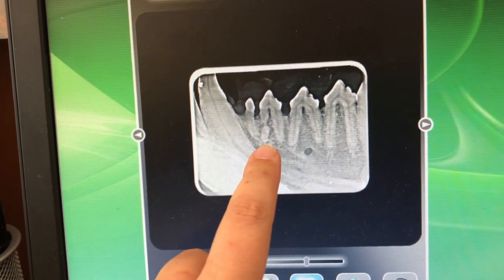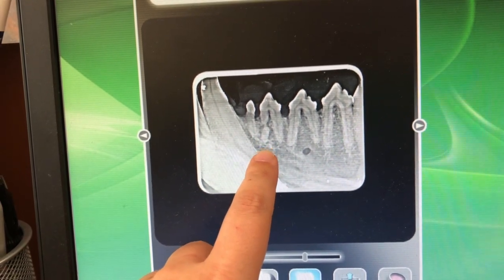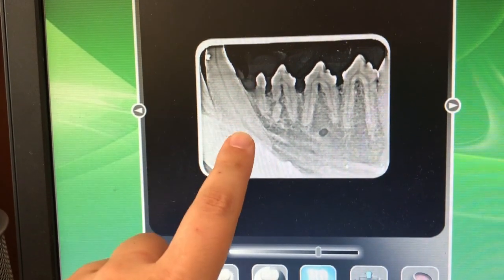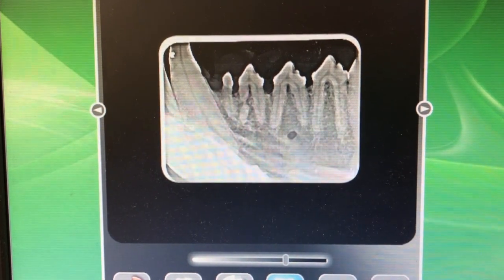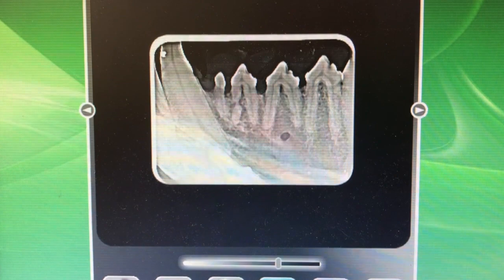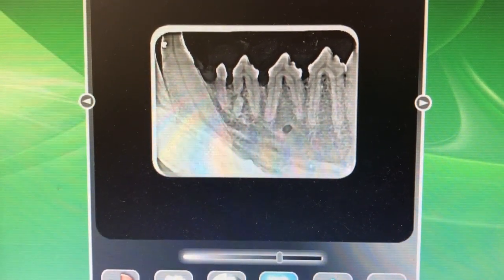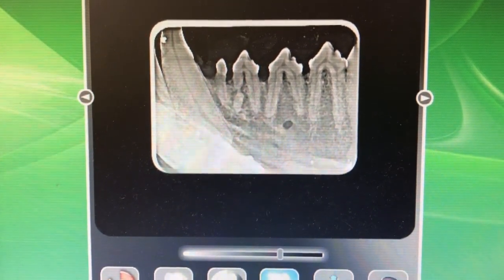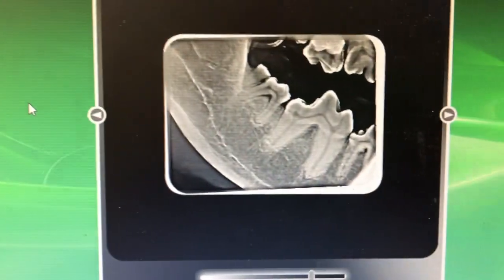The interesting thing that I wanted to point out is this our second premolar, 306 here, the root is actually fragmented from the coronal aspect of the root here, and it looks like it is from tooth resorption. So it looks something that we usually see in cats a lot, but not so much in dogs very often, so it's interesting to find it in Austin. It doesn't seem to be affected or infected or bothering. There's no abscess there, so it looks decent. It looks okay.